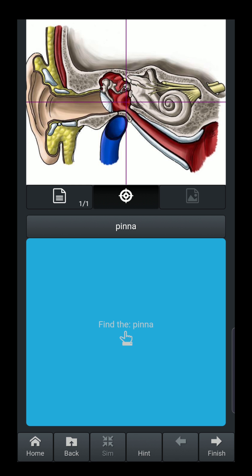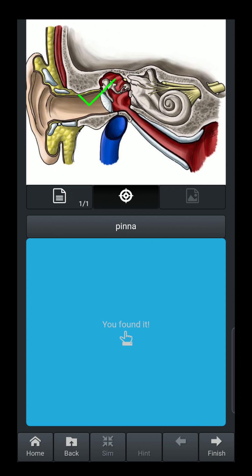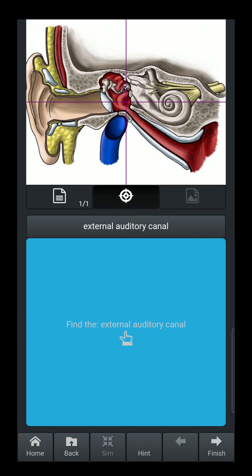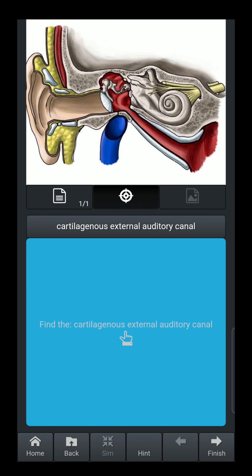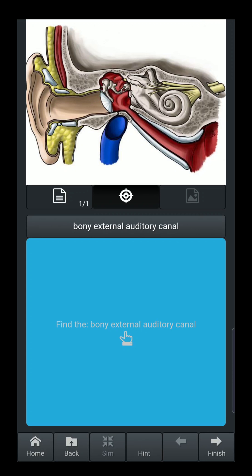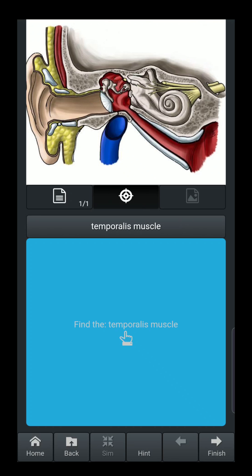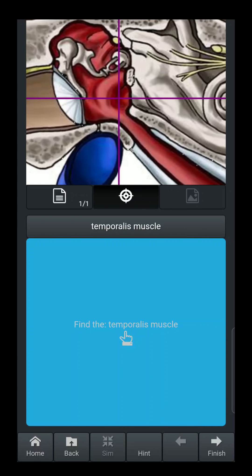The targeting mechanism appears, and you move it to where the pinna is and tap on the blue screen. It verifies that you've hit that anatomy, then automatically goes to the next target to identify — in this case, the external auditory canal. If you want to magnify the top screen, you can use the pinch technique on the upper portion of the screen to enlarge the image, which is useful when dealing with smaller structures of the inner ear.